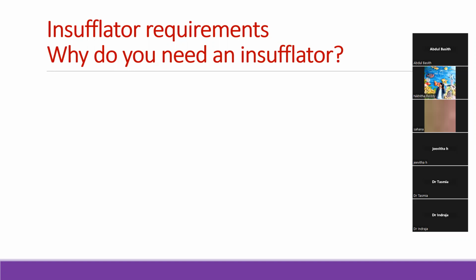Why would you expect low pressure? Sir, if you did not have an insufflator, why would you expect low pressure? Gas leaks. Yes, all right. Yes, gas leaks.